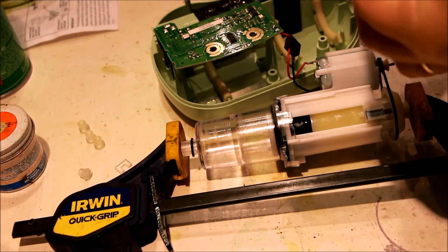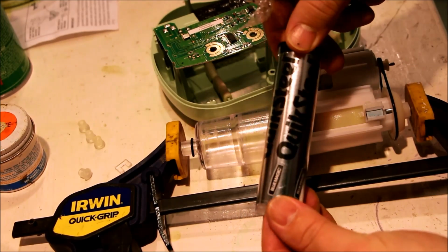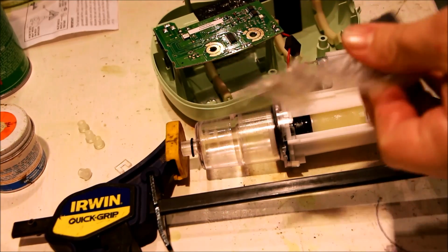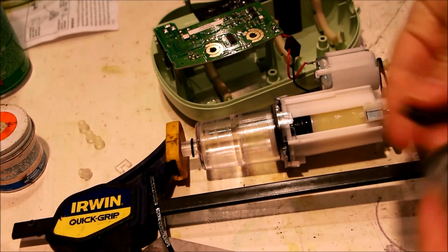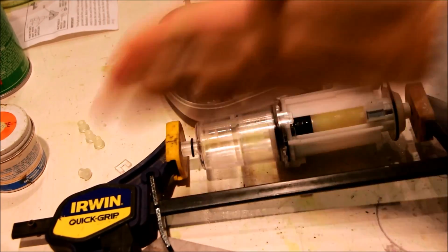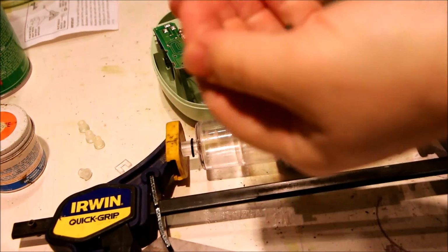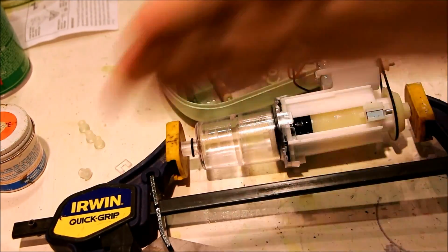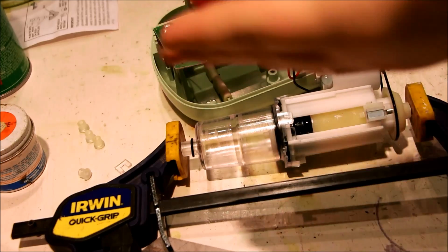Okay, so we're rolling again. This is quick steel, in case you haven't seen it. I love this stuff. I happen to have a little bit of extra here. We don't need very much for this job. Need a knife to cut it, though. Okay, so you take a small piece like that, and roll it. So all I'm going to do is try to make a C-clamp effectively over this spot and see if it holds.